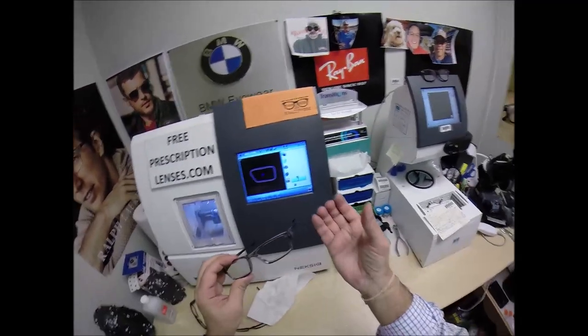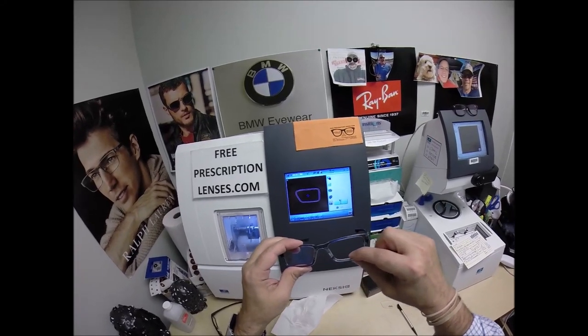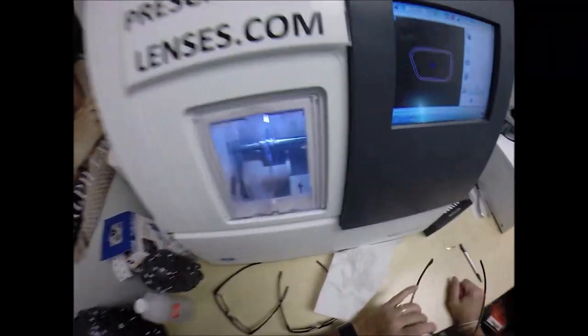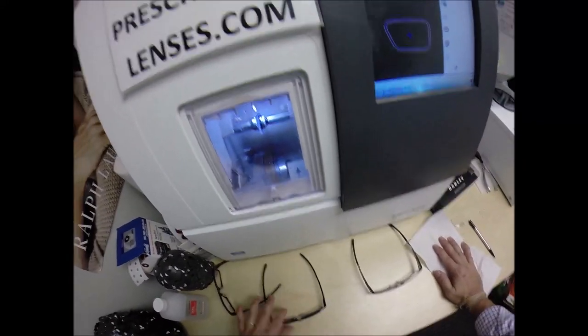We in the industry say roll, if you can imagine your frame like a gutter. If the lens were too large, the skinniest part of your frame, which is here, would roll outwards, giving you an ugly cosmetic look, as well as shortening the life of the frame. So you want a perfectionist like me cutting your lenses.